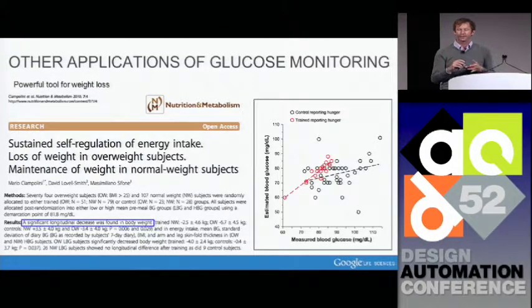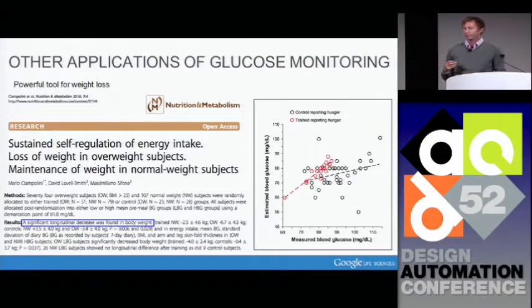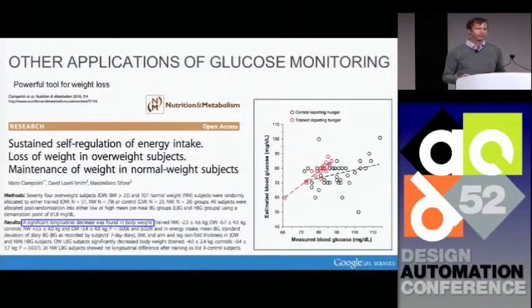We'll have them prick their finger for 2 weeks. And then after that, hopefully people would just kind of know. You would get a feel for what your blood glucose is. And that's the next best thing to actually having the information. So go through a 2-week training period. And this data on the right shows that unfortunately, that didn't work out very well. People are not good at being able to just somehow know their blood glucose. You can't predict it because you may feel hungry, you don't feel well, it's hard to predict. It's something that you need to have an objective measure.